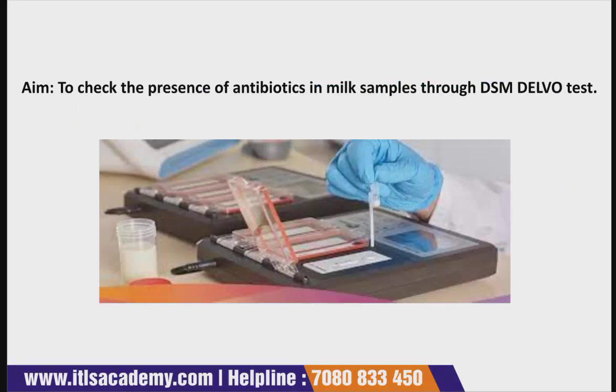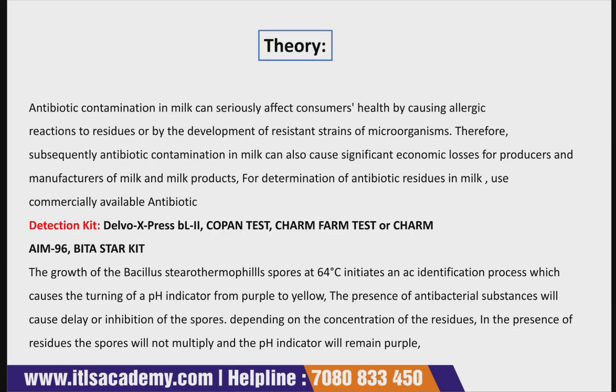Now today's aim is to check the presence of antibiotics in a milk sample through the DSM DELVO test. So what are DSM and the DELVO test?